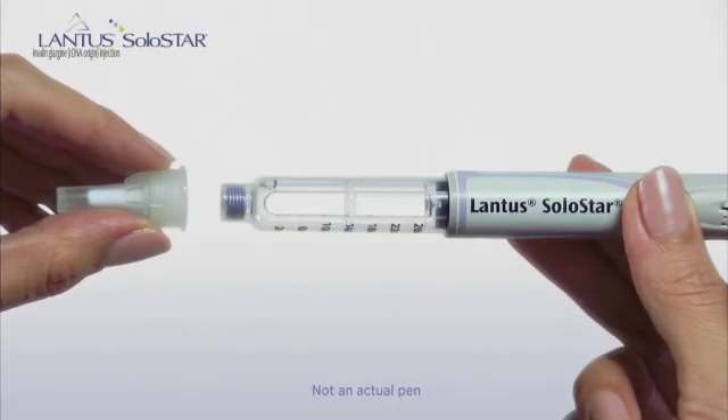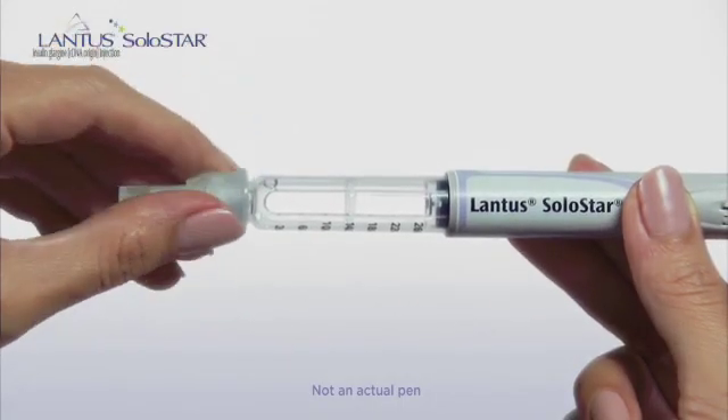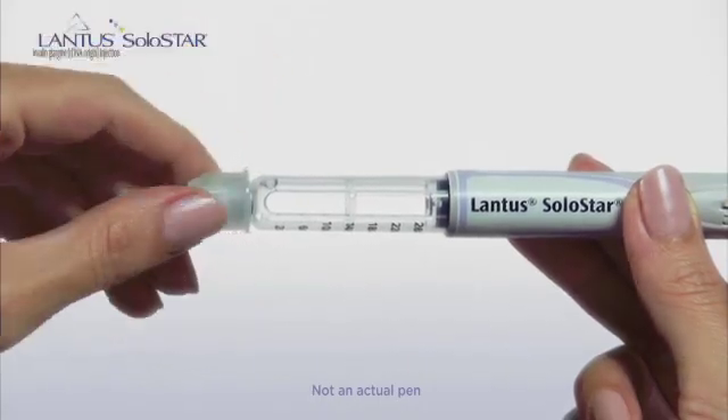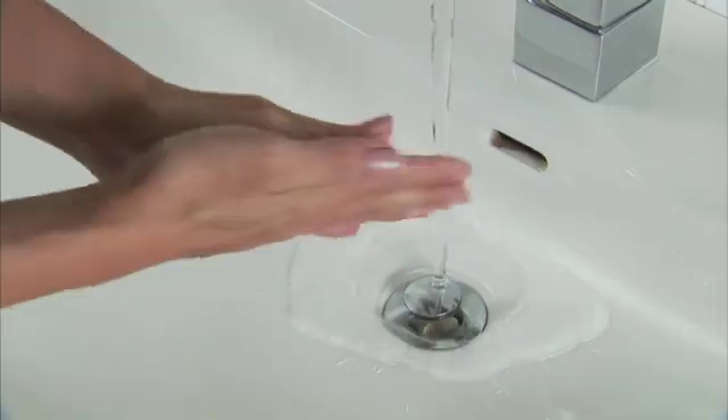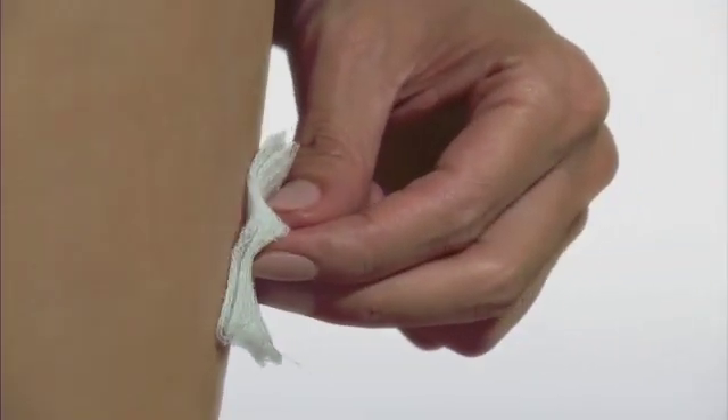Always attach the needle first before dialing the dose selector, and always use a new needle. Always wash your hands with soap and water before an injection, and remember to clean the injection site with alcohol.